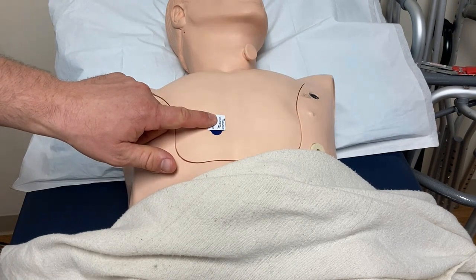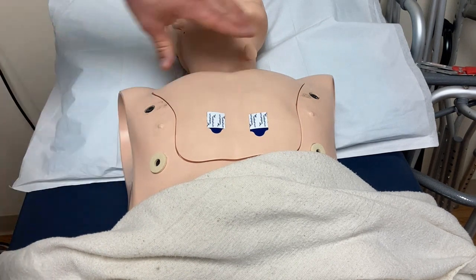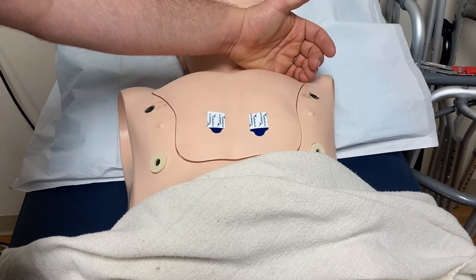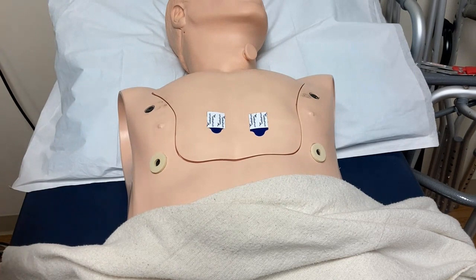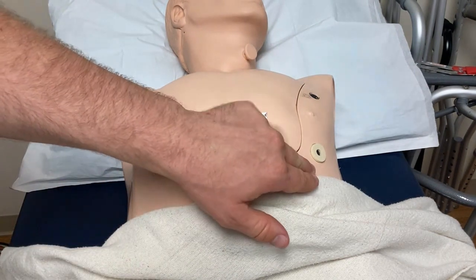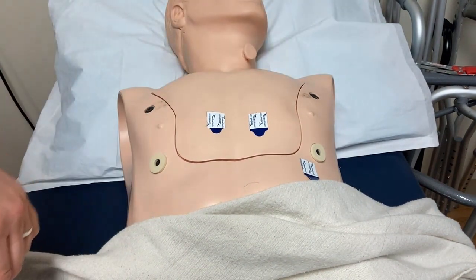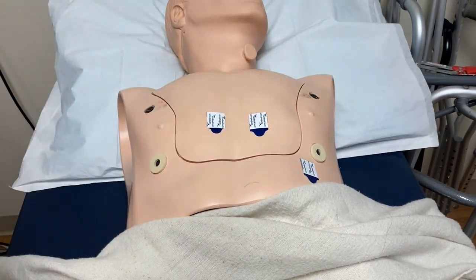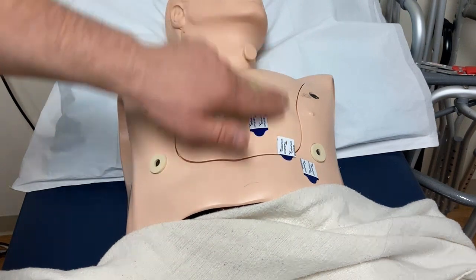V2 is the same as V1 but on the left side — at the fourth intercostal space on the left sternal border, at the same height as V1. Next, find the mid-clavicular line — the middle of the clavicle — and follow it straight down to the fifth intercostal space, between ribs five and six. That's V4. V3 is placed right in between V2 and V4, centered both vertically and horizontally.